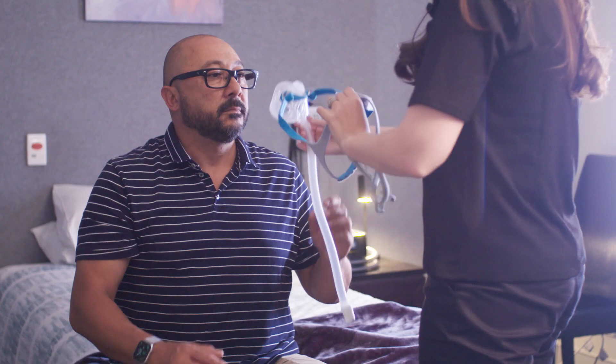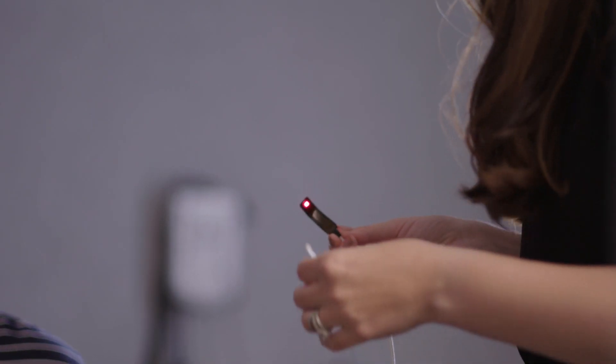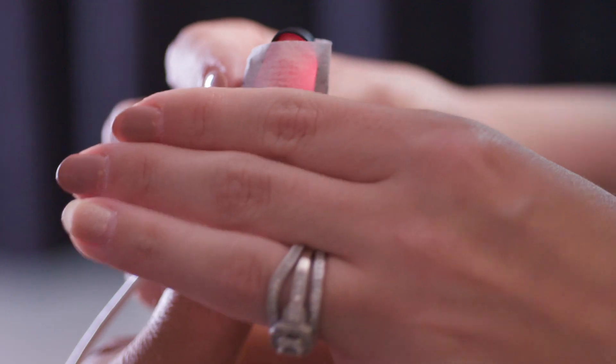We've just finished the validation of the Evora Full mask, and from that trial we found that over 90% of participants found the mask stable, and almost everybody found that the mask was compact on the face.